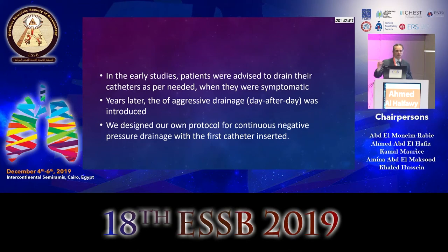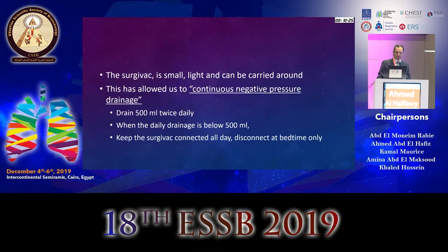When I used the SurgiVac, it was very light, and we designed a special protocol for draining these patients. We called it continuous negative pressure drainage. The drainage container is 500 milliliters. I asked my patients to drain twice a day, once in the morning and once before going to bed.